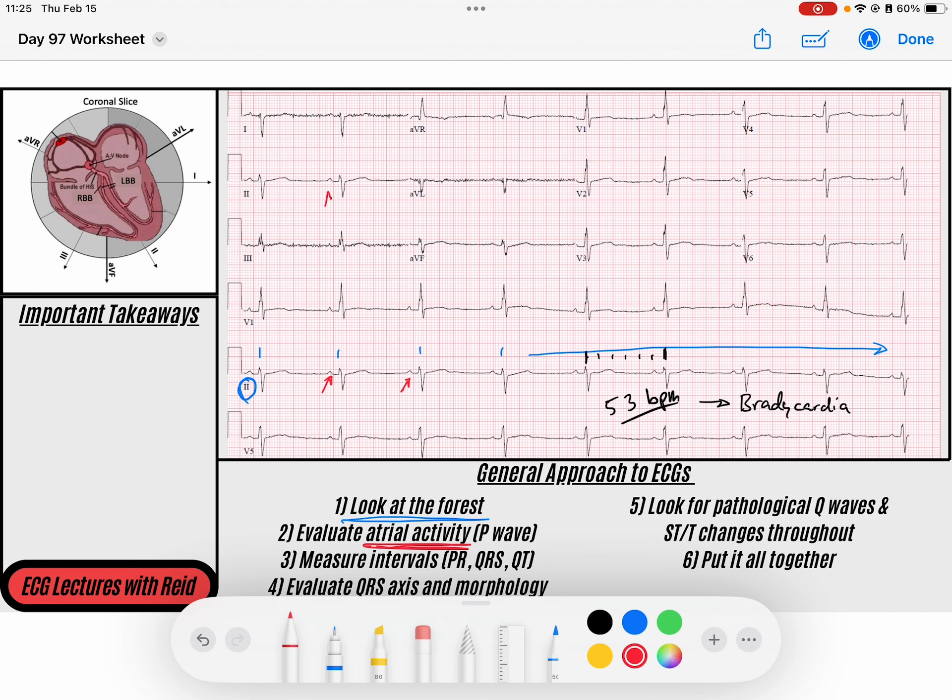My P waves, if I scan up here, are upright in lead 1. There's a little bit of artifact in lead 1, but you can see an upright deflection. And then you can also see an upright P wave here in AVF. It tells me that my atrial depolarization is occurring in the down and to the left direction, which is normal for sinus node. So this is a sinus P wave.